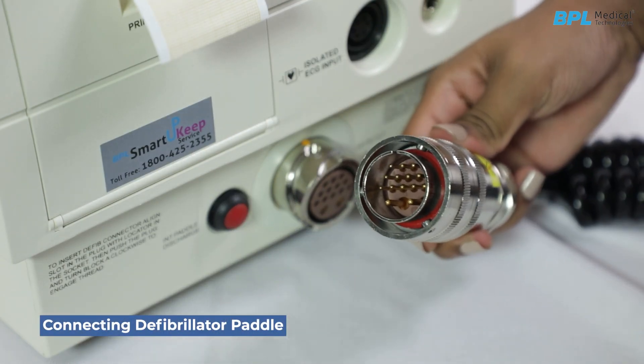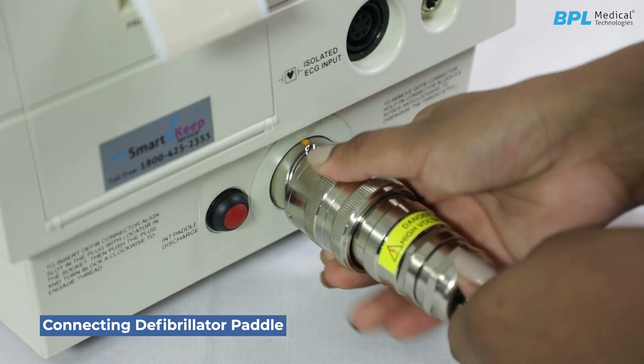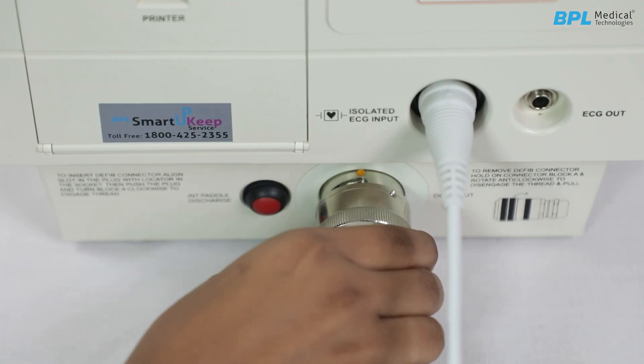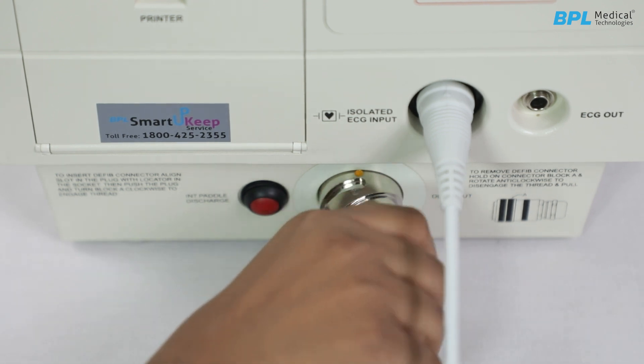Connecting the defibrillator paddle. Insert the paddle into the holder on the defibrillator unit side. Align and insert the defibrillator plug into the output socket at the unit's front bottom panel. Rotate the plug clockwise to secure. To remove, rotate the connector anti-clockwise and gently pull to detach.